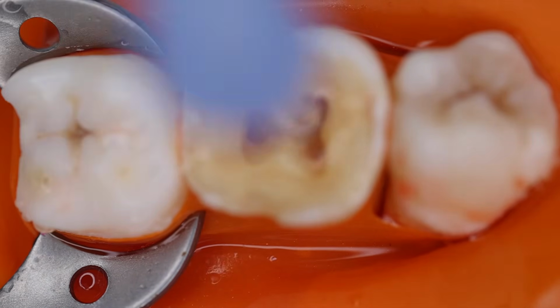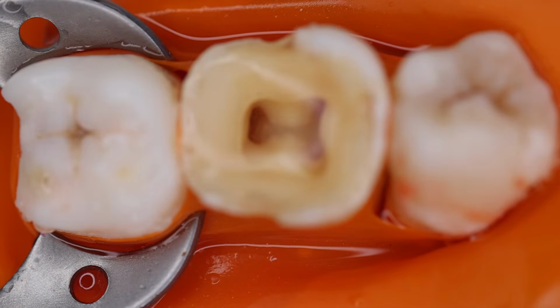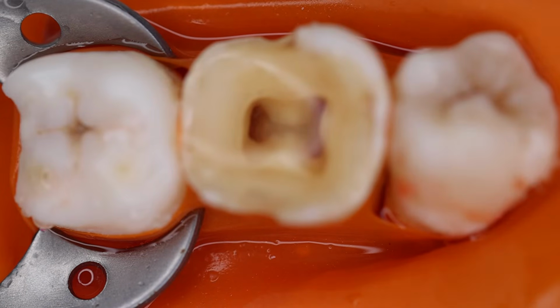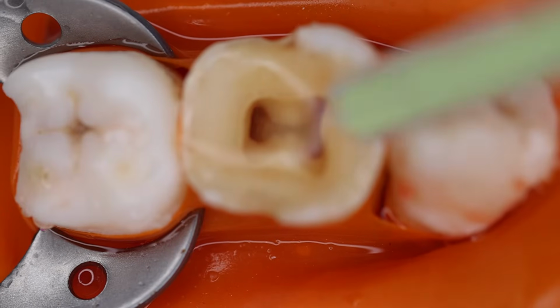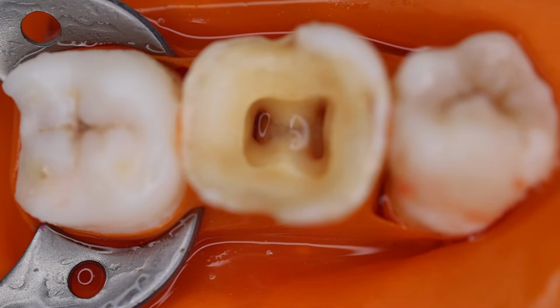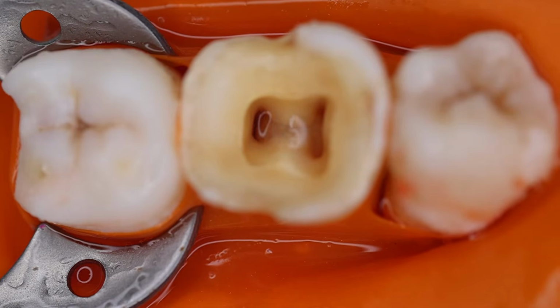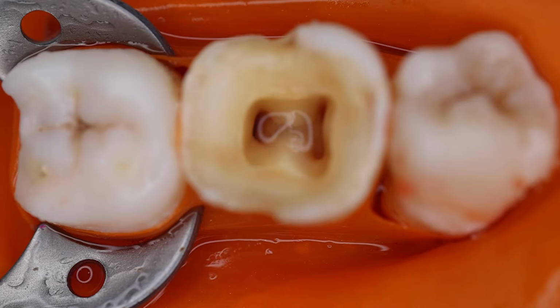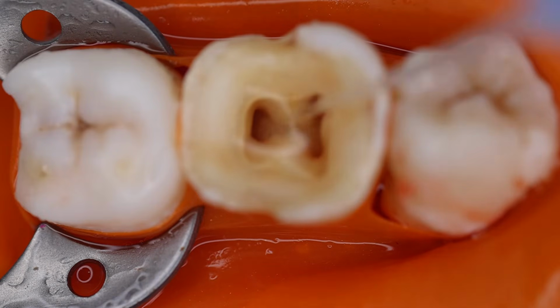Once you irrigate with sodium hypochlorite, the next irrigant that you may use is saline as an intermittent irrigant. Do not blow directly, blow horizontally if you need to. That would be sufficient. These canals have irrigant inside, nothing to worry, just flush out the sodium hypochlorite with saline and again re-irrigate. So now the second irrigant would be the saline with a side vent needle.